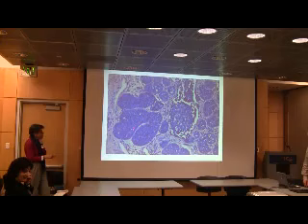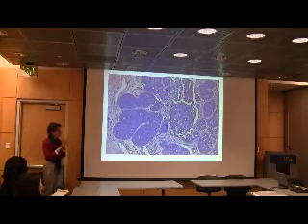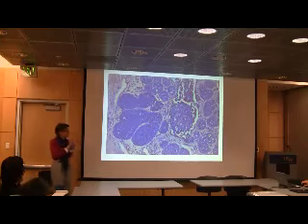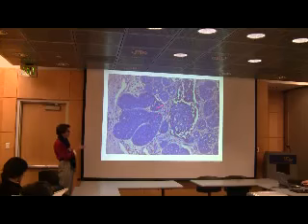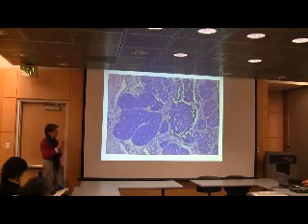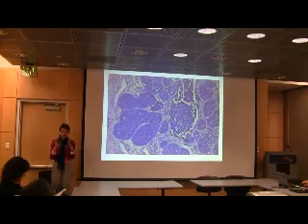All right, so here's an example of a lobule that has been greatly expanded by lobular carcinoma in situ. You can see what happened here is that the lobules no longer have any spaces in the center. The cells have proliferated, so they have crowded out those little spaces. And if you had something that just had crowded out the spaces, but the size of the lobule was still the right one, then we call it lobular hyperplasia. But it's not just considered to be carcinoma in situ. But when you get the lobules expanded to this degree, then we call it lobular carcinoma in situ.